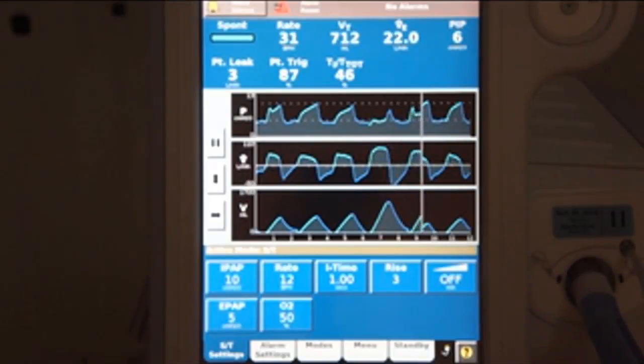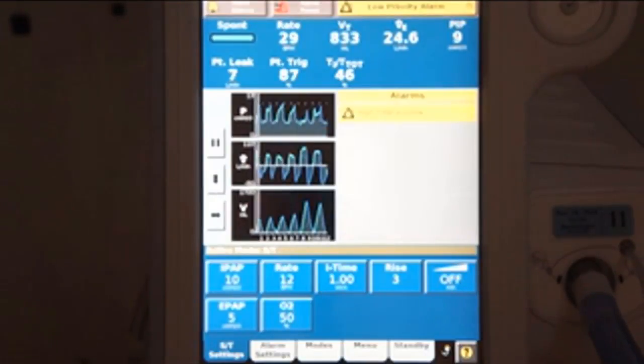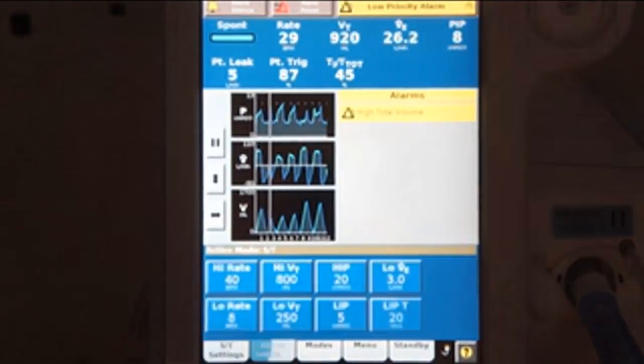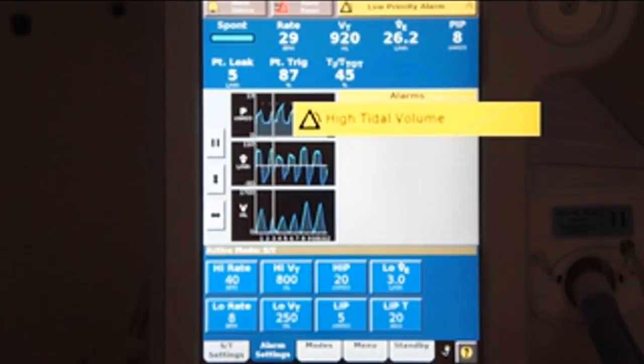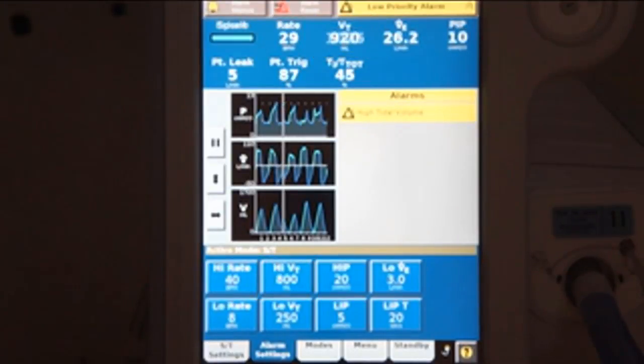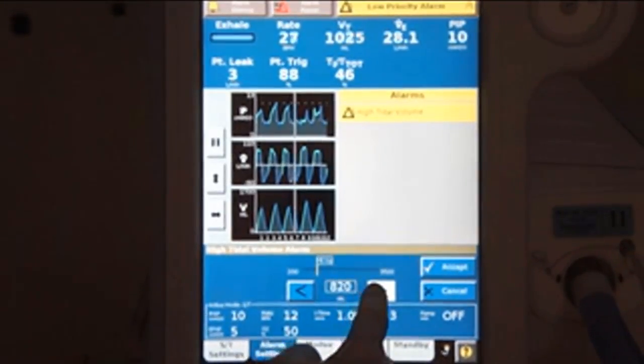Adjust the alarms in accordance with the clinical scenario and ventilator settings. Assess the patient whenever an alarm occurs. In this case, the patient's tidal volume is greater than the high tidal volume alarm threshold. If this tidal volume is acceptable, however, the alarm threshold can be adjusted.